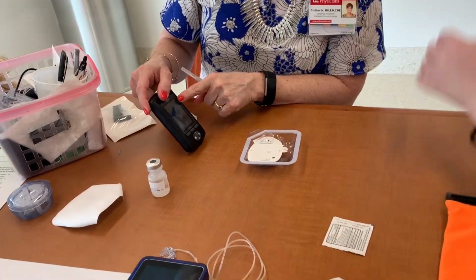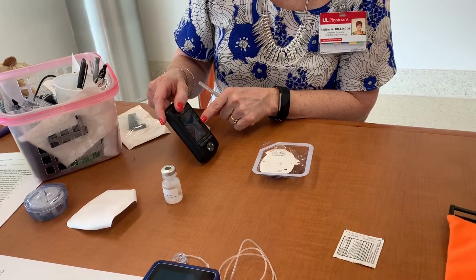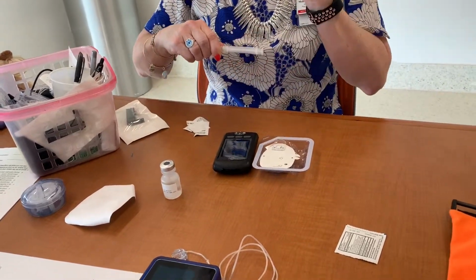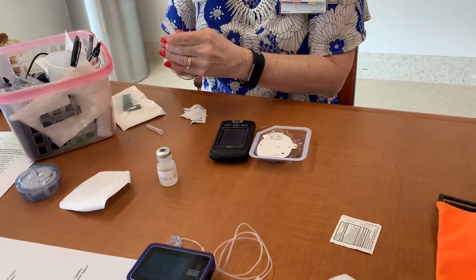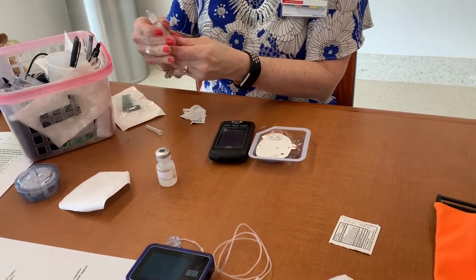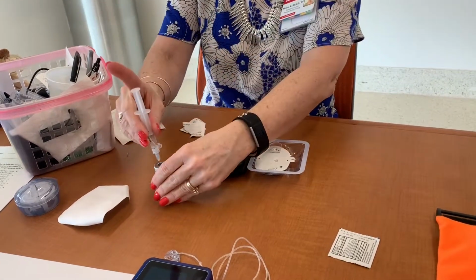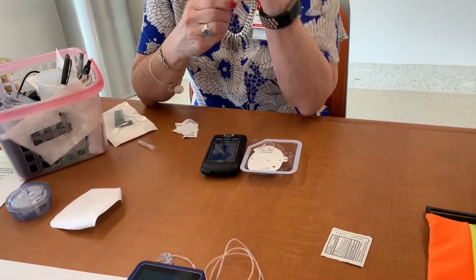Okay. So it says, fill a new pod with insulin. After filling pod, listen for 2 beeps, then press next. So we're gonna put some insulin, it's water, in there, and then we're gonna listen for 2 beeps, okay? And once again, this needle never touches your body, okay? Everybody's always nervous about this needle. It doesn't touch you. If it does, we just had an oops.